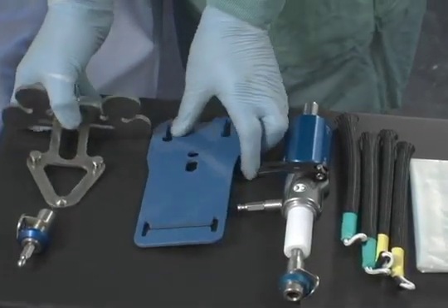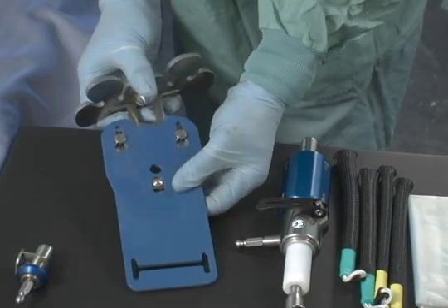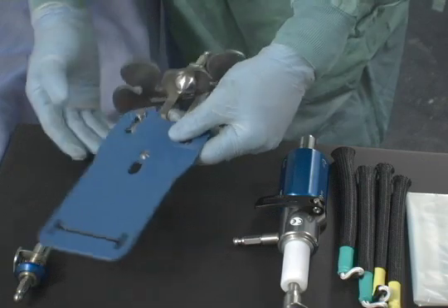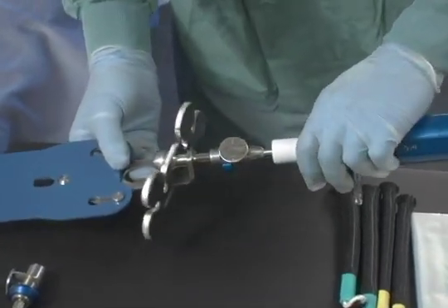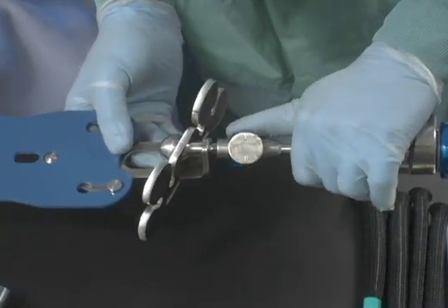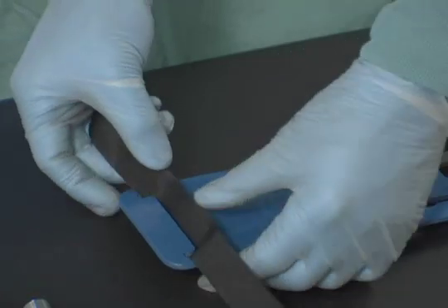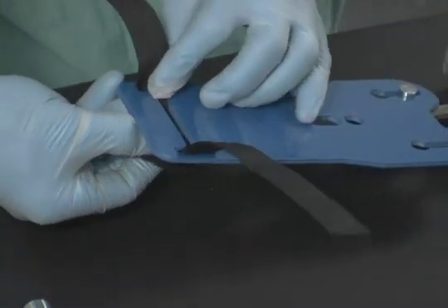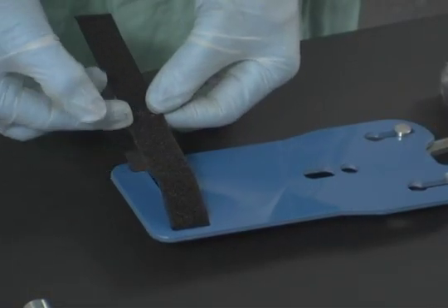The wrist plate is slid onto the wrist arthroscopy accessory. The lower part must insert into the bottom hole. The wrist arthroscopy accessory is then inserted into the traction accessory. The wrist strap is then threaded onto the wrist plate, attached so that the velcro side is facing up.